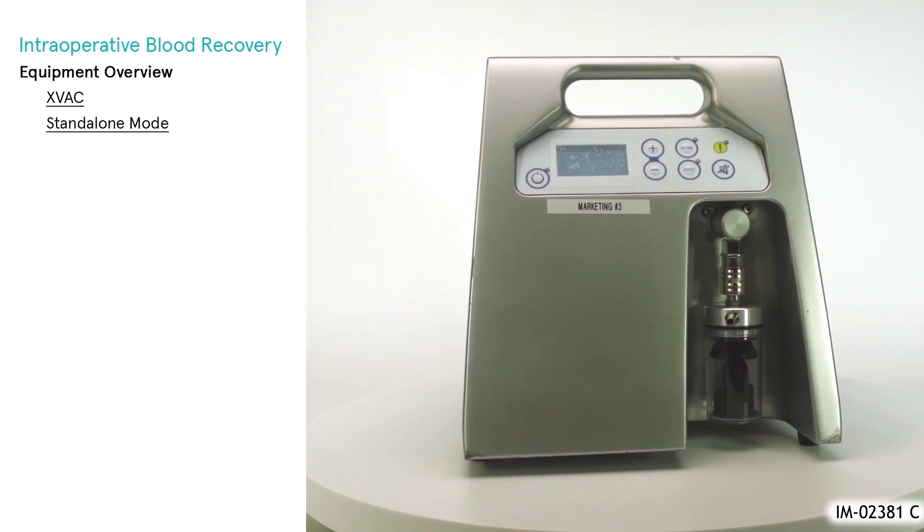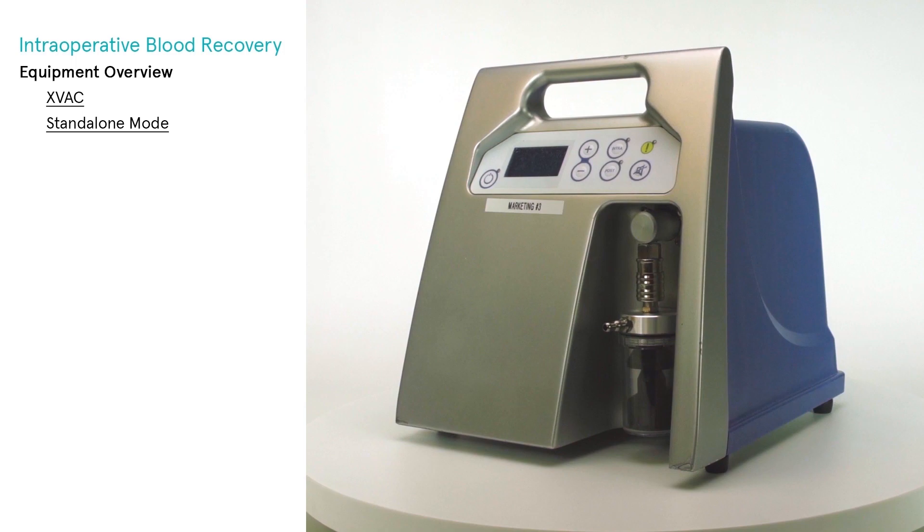The vacuum module may also be used as a standalone vacuum system, completely separate from the Extra, controlled using its built-in control panel and the additional power cord provided.